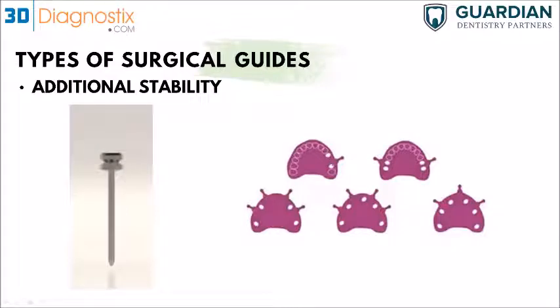So here we've got a canine and a molar. So this is a long span, and that would also prevent having the guide flex. And of course, with the flexing, maybe just have the osteotomies a bit deeper, and you've got the sinus and stuff. So you need to make sure that everything is supported fine, and the fixation pin is just going to ensure that.